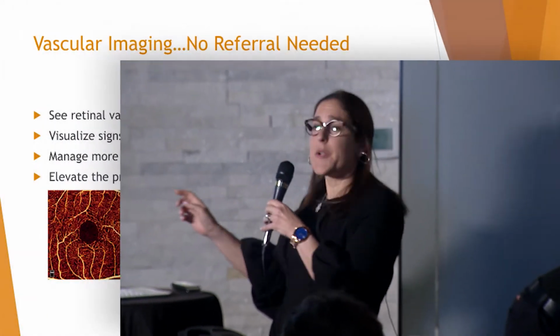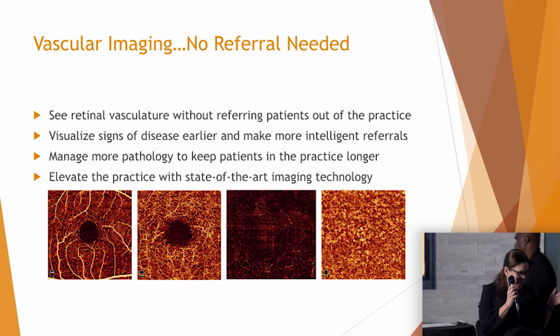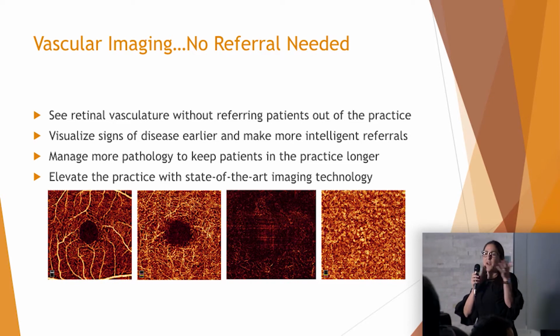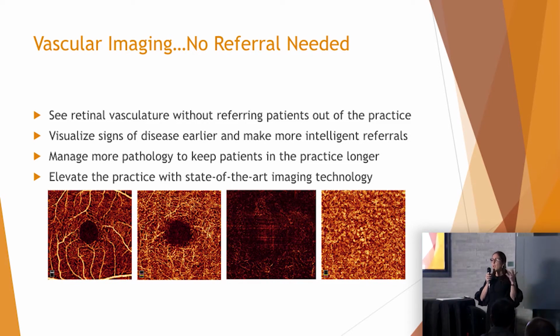So moving forward, what is OCTA? We're going to start off with the basic question. We all know that OCTA is allowing us now to visualize retinal and choroidal vasculature non-invasively. Well, who cares, right? We've been practicing for 30 years without it, however many years, hundreds of years without it. Why do we need it?